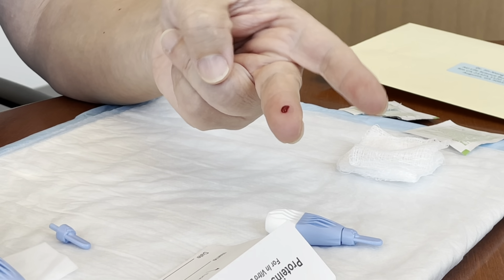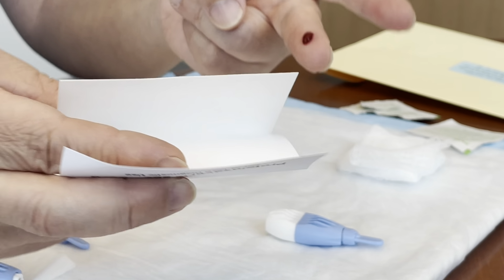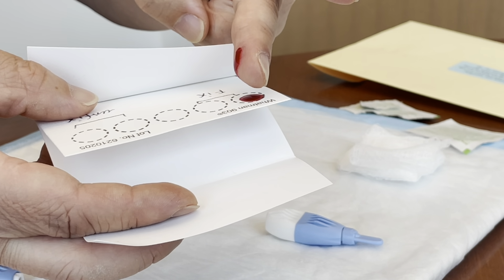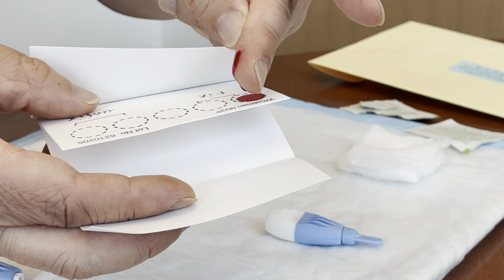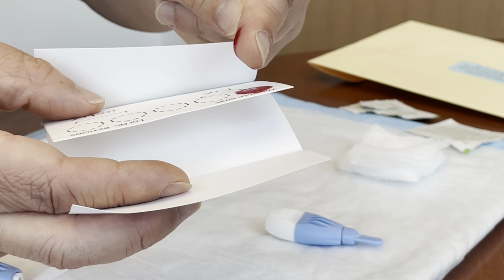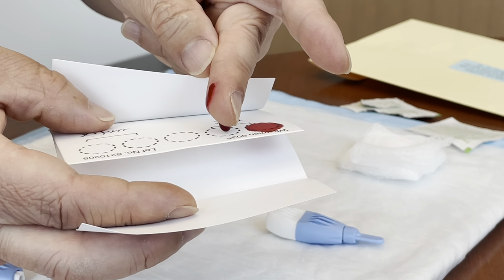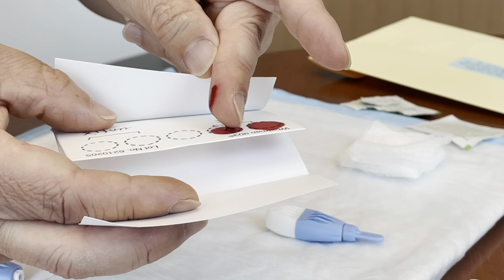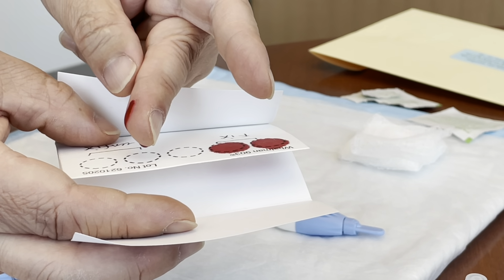When a drop of blood forms, pick up the filter paper and allow the blood drop to fall into the first circle on the card. You want the blood to fill the whole outline circle on the card and soak through the filter paper, so it might take a few drops of blood to completely fill the first circle. When the blood spot fills the whole circle, you can move on to the second circle. Continue to add drops of blood to the second circle until it fills the circle to the edge.